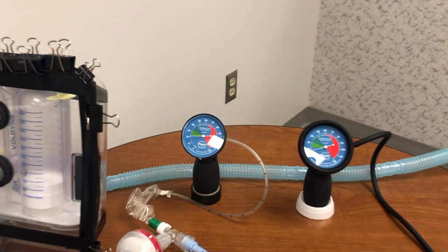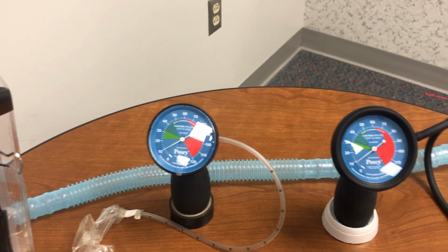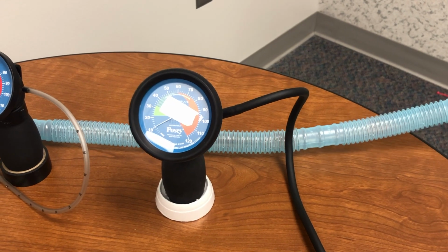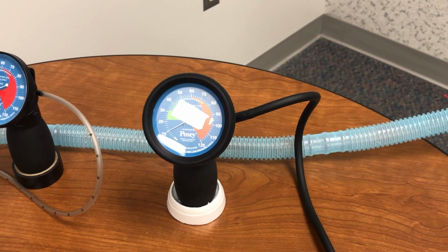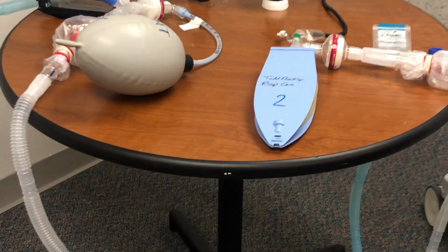Now if you see, the pressures of course have increased, because we wanted to increase the pressure. We opened the valve to 34, but if you see on the other patient, the second patient, the PEEP stays at around 8, the pressure around 20. There is not even a single digit pressure change in the other patient, and the ventilation is the same way.